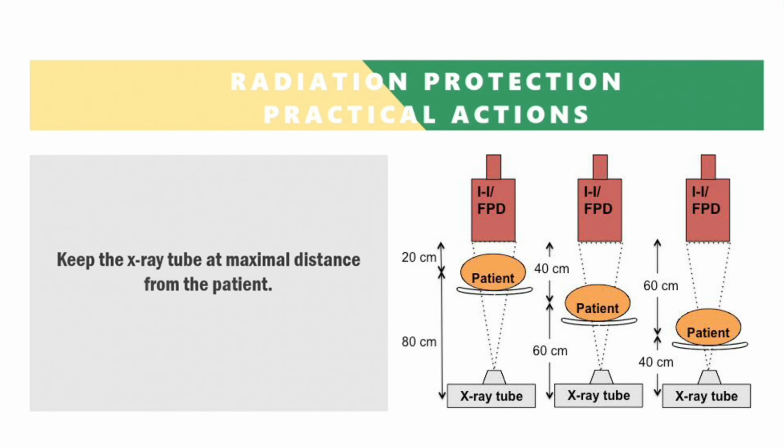Next is to maximize tube to patient distance. The further the X-ray tube is from the patient, the lower the radiation exposure. It is a simple yet effective way to enhance safety.